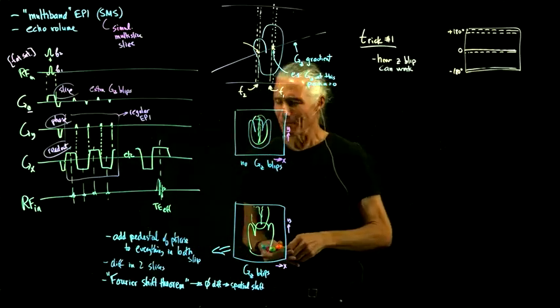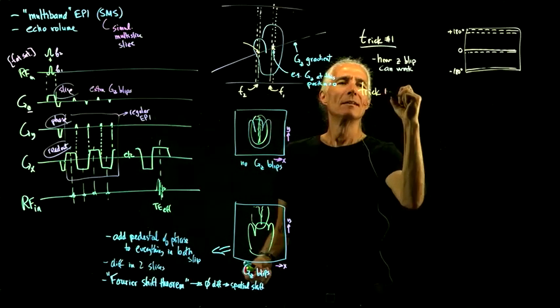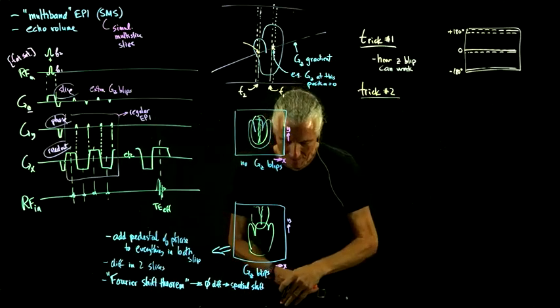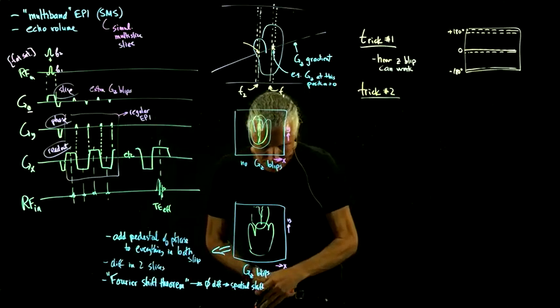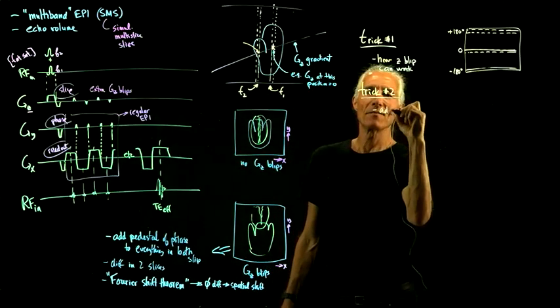So that doesn't seem very general, and so trick number two, what we could do is essentially add phase.